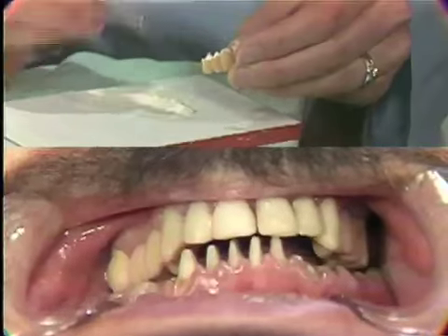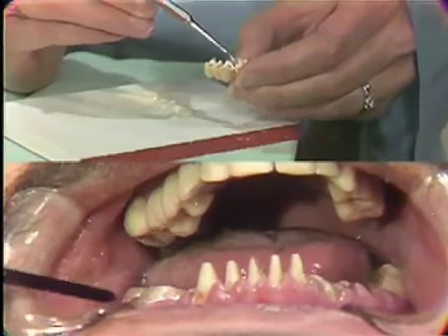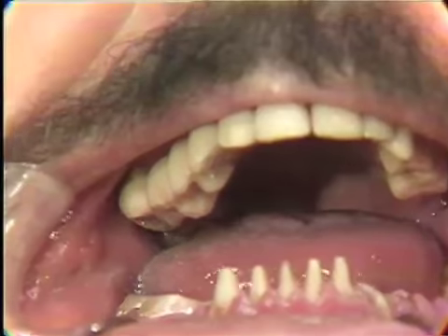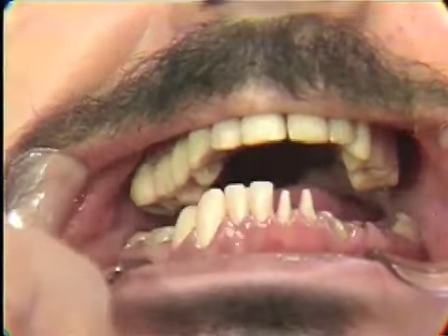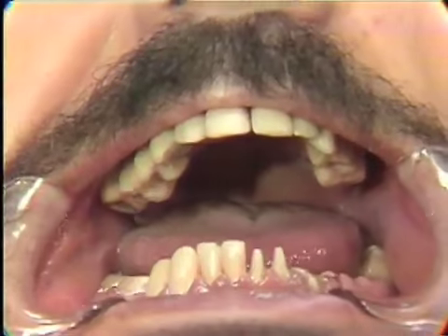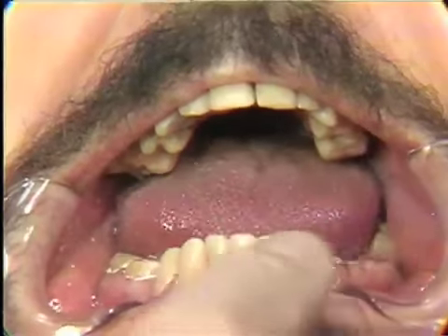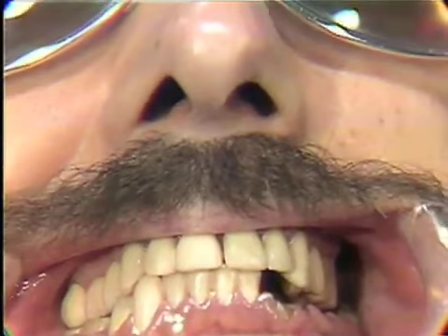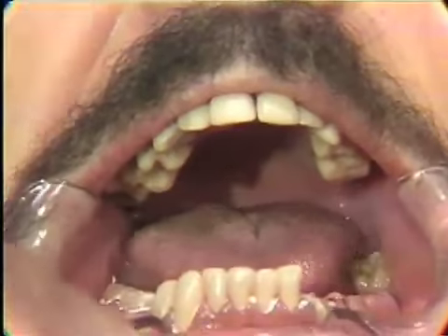Notice that there isn't a lot of temporary material running all over the place as we cement the crown in place. There's a nice little bead of temporary material that comes out from around the temporary. Close, please. Open. Close, please. Open. As you can see here, there's a thin bead.